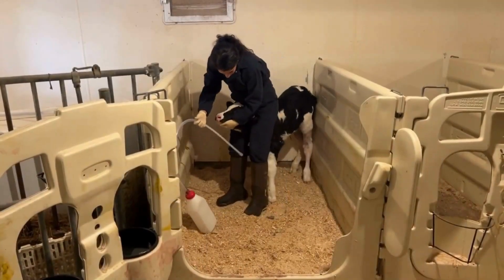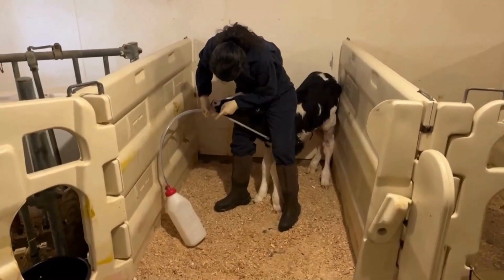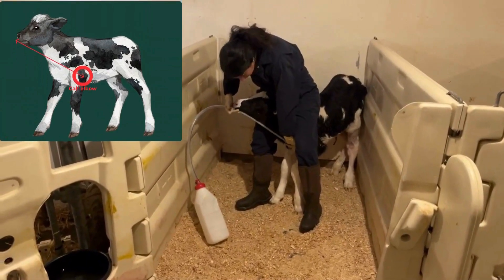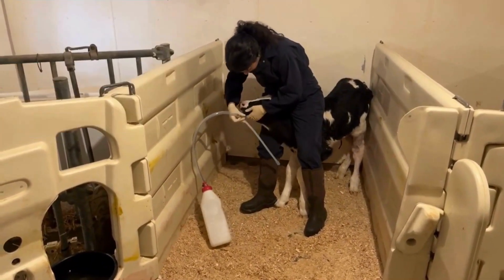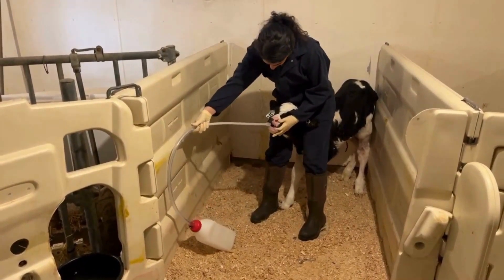Now that you have the calf restrained, it is important to determine how far you can insert the tube. This can be done by measuring the distance between the calf's nose and its elbow. Now that you know how far to insert the tube, you can start the process.